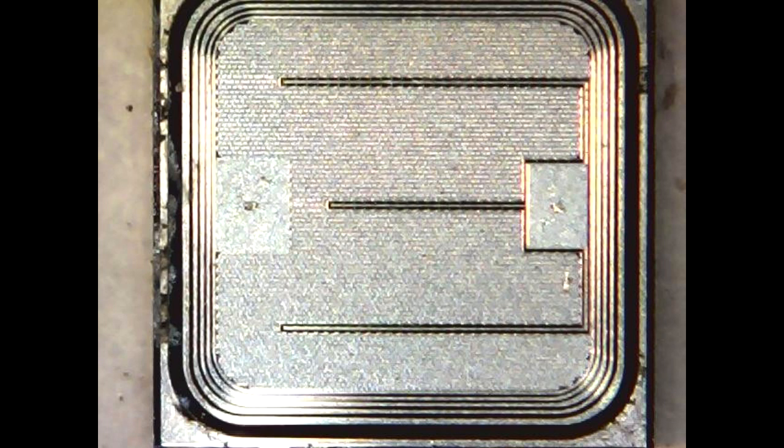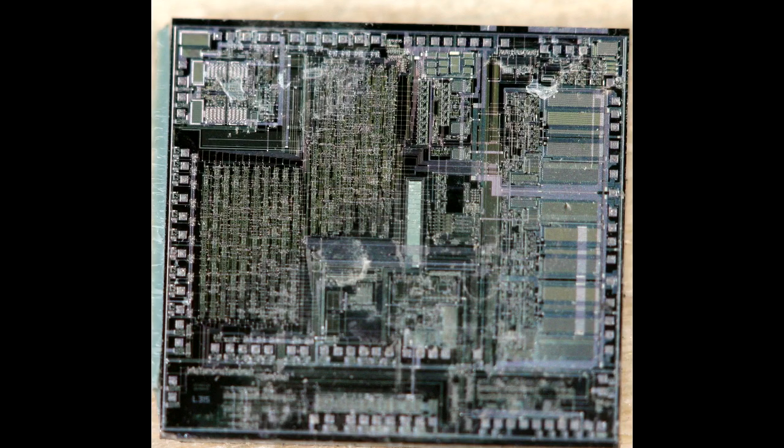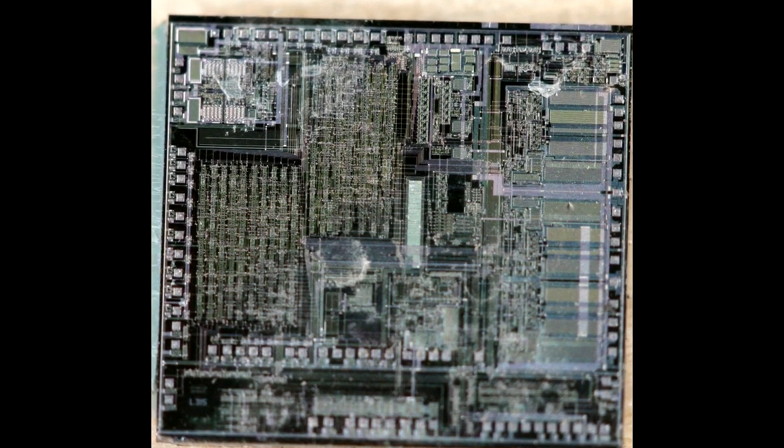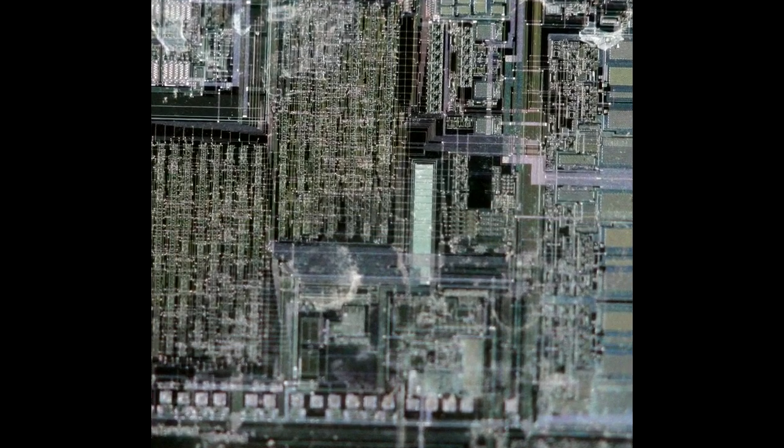Here's a close-up of that chip. It looks like it's something like a MOSFET. It's very simple features. This is one of the other chips. There's quite a lot of different features here. It's not really clear what this is. There aren't any big chunks of memory or anything. There's a few areas that look like they may, here for example, look like maybe gate arrays, but then there's those odd-looking large sections, and as you go around the chip there's just all sorts of very different looking features. Maybe these bits on the right are perhaps output drivers or protection circuits or something. They seem to be quite big features. But there's quite a lot in this.